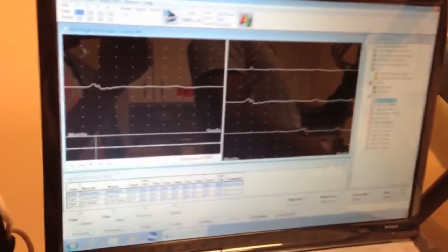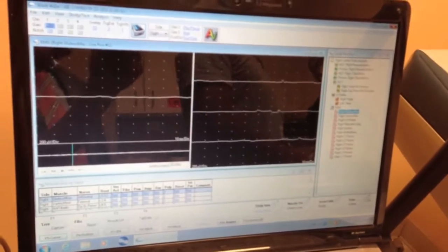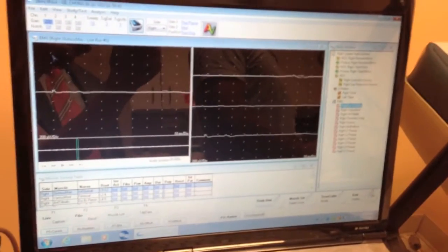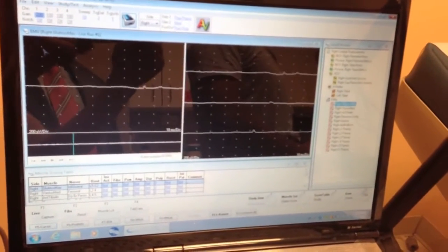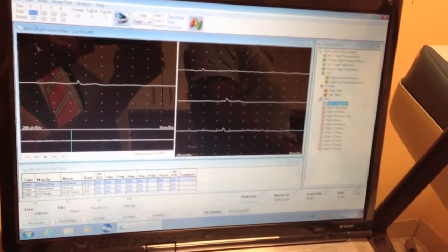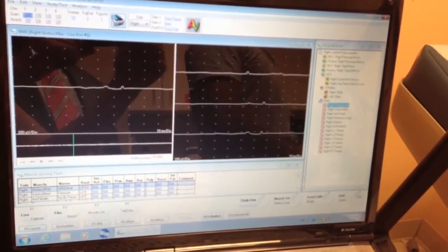The video shows the EMG, and now you can start. It's recording, right? Now it's recording. Yeah, now it's recording.